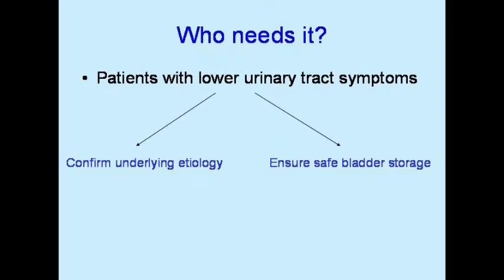Coming to the next question as to who needs it, basically the non-invasive urodynamics most of our patients would have already had, and the usefulness of that simple non-invasive urodynamics is that it is quite reassuring both for the clinician and the parents when we can confirm our clinical suspicion on the simple investigations. The invasive urodynamics ensures that the bladder is a safe storage organ.